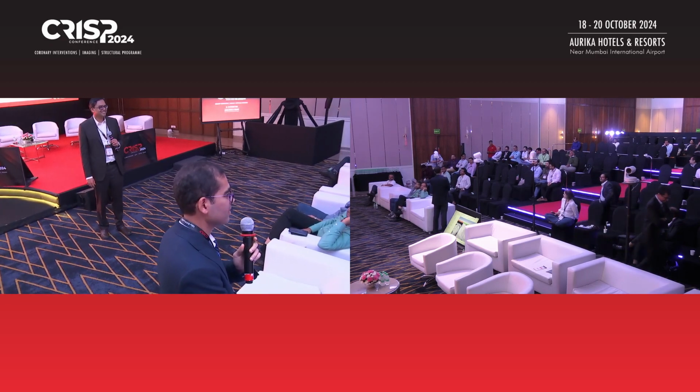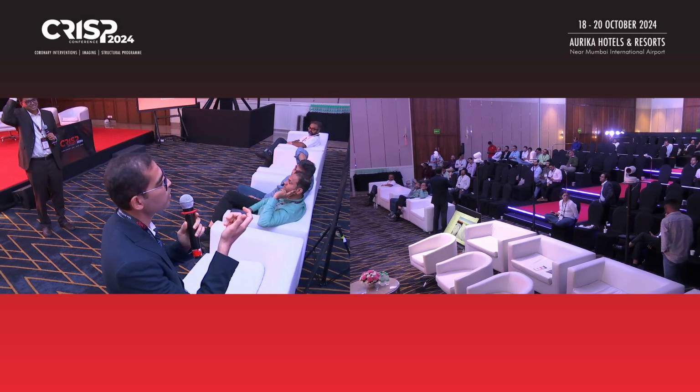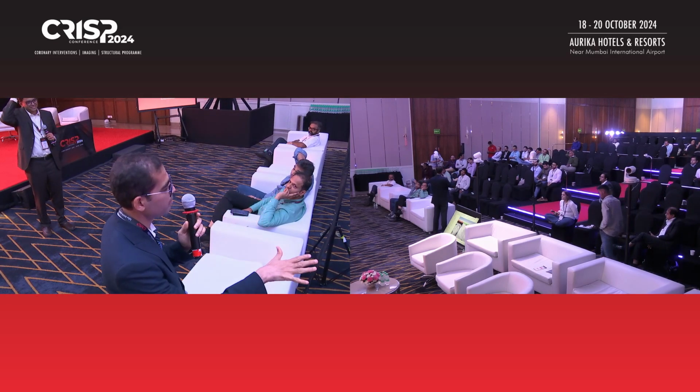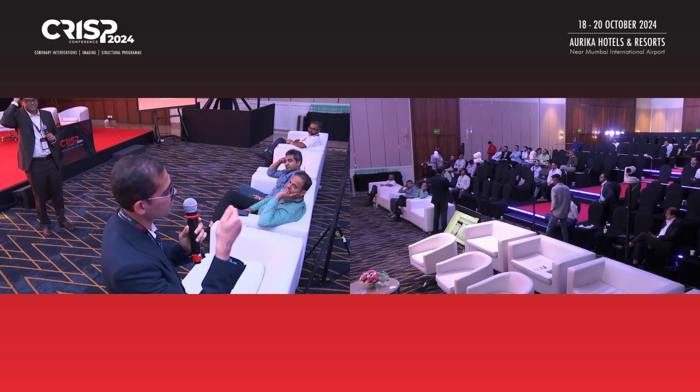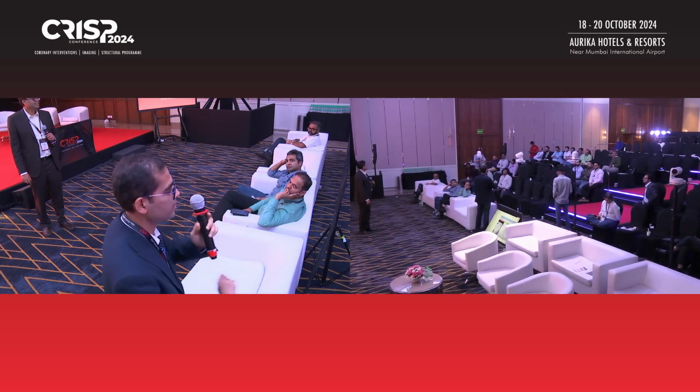So many a time, you just take one ProGlide and then see how the flow is. If the blood flow is okay, then don't pull the second ProGlide. Just leave it like that.